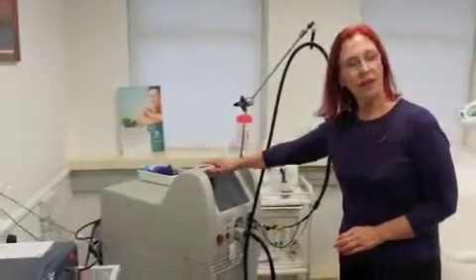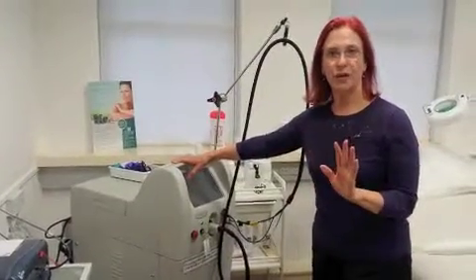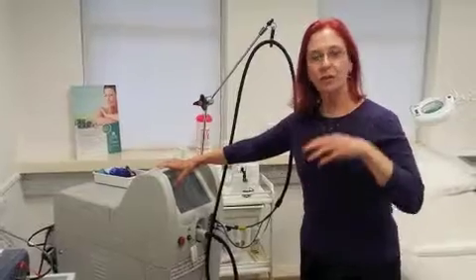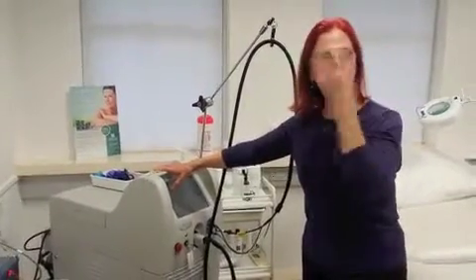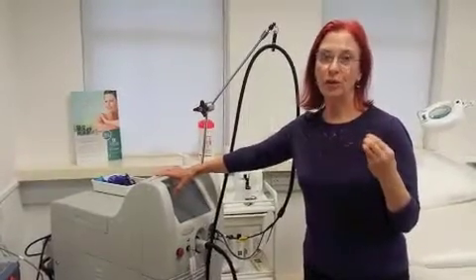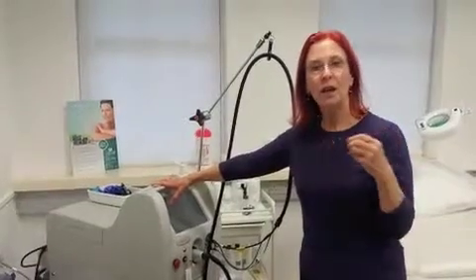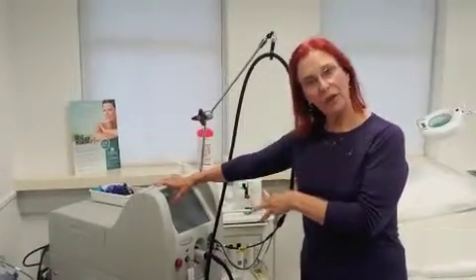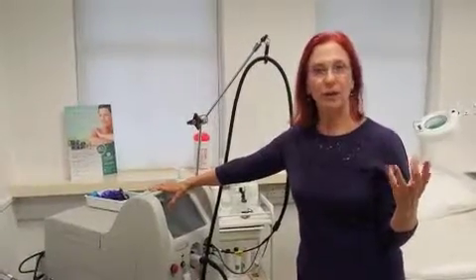This is our fourth treatment room downstairs and this is our vascular suite of lasers. This is a pulse dye laser with a variable pulse. We can treat warts and freckles, the red birthmarks known as port wine stains, facial vasculature. I can also treat people with rosacea with this and prevent the embarrassing flushing that people get. We also use this a lot for healing after treatments and with any skin problems.